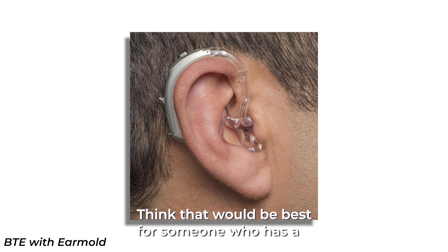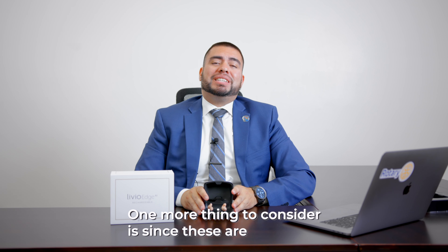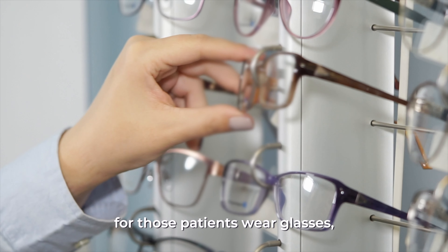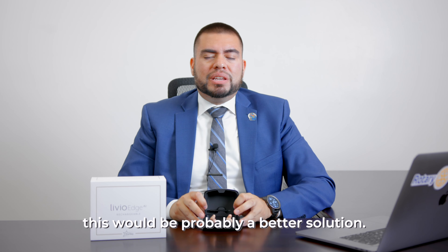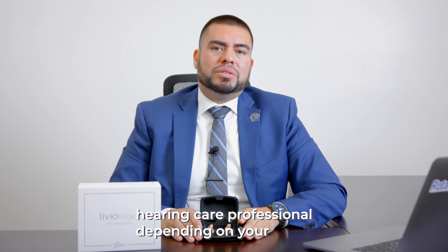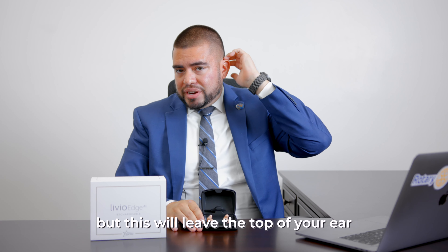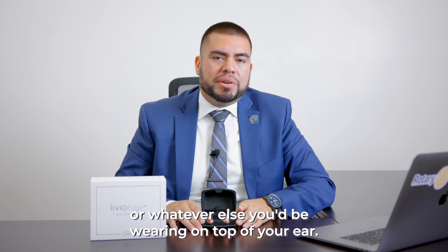One more thing to consider is, since these are custom hearing aids that only go inside the ear, for those patients who wear glasses or with the pandemic everybody's wearing masks, this would probably be a better solution. You might want to consult with your hearing care professional depending on your hearing loss and other factors, but this will leave the top of your ear free for your glasses, the mask, or whatever else you'll be wearing on top of your ear.